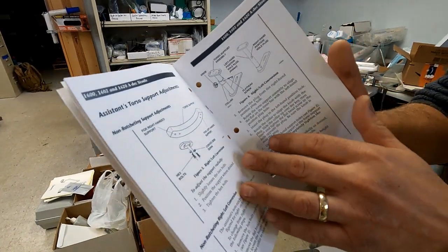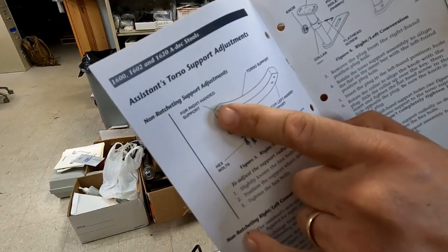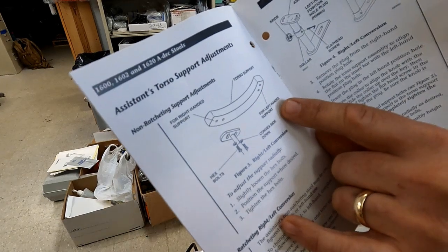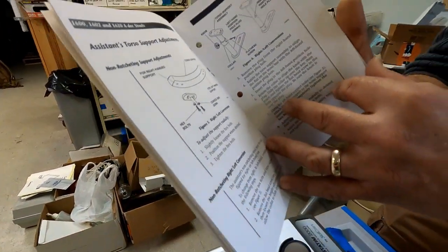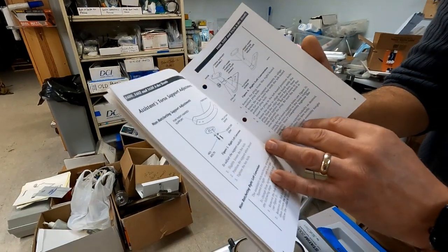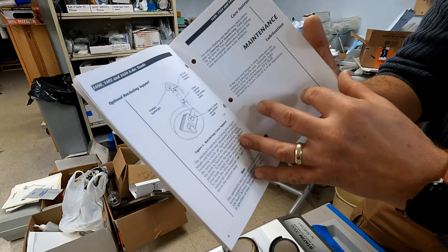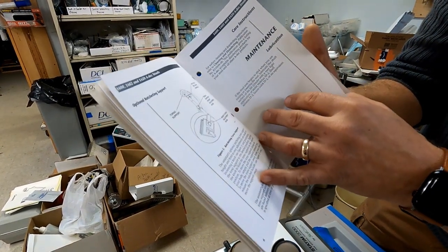The assistant torso adjustment. Like, for instance, did you realize that if you have a dental stool, you can change it from right-handed to left-handed? You can do that all yourself with a simple tool. It has all the instructions right here, and it's great. But I already knew about that. Then there's how to do other things. And then there's how to ratchet. And you probably knew most of these things.